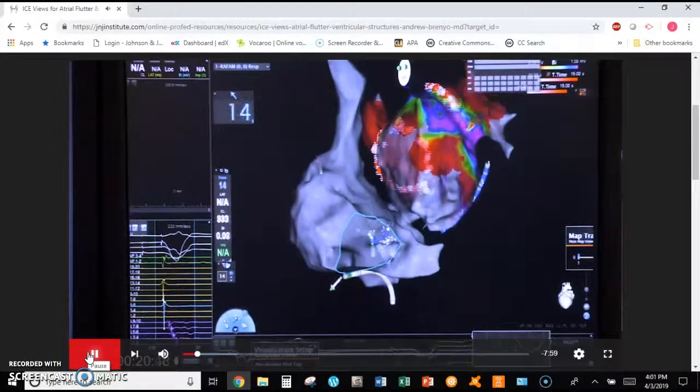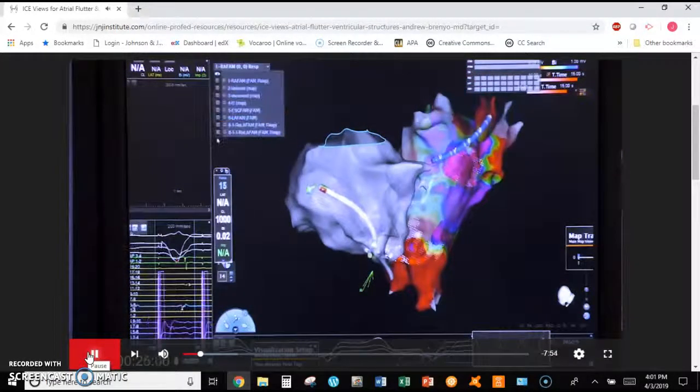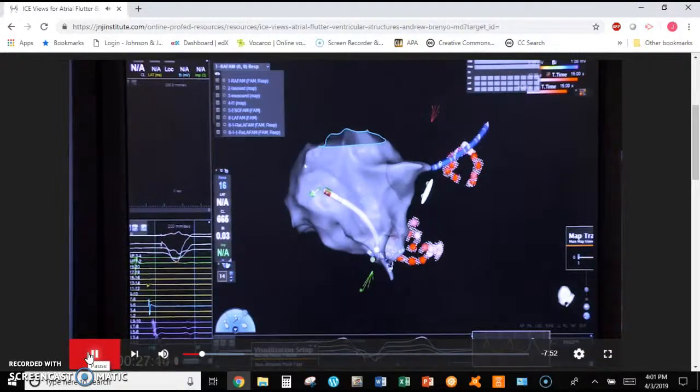Pace from CS to me. Pull up. Yep, that's good. Not that fast. There you go.